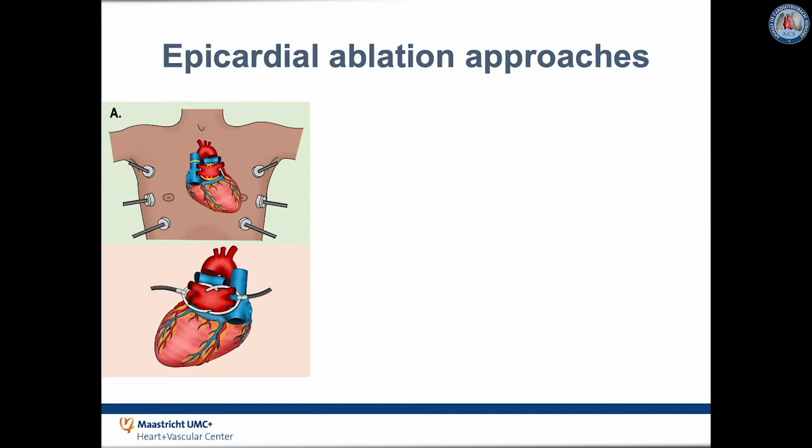Now there are several ablation approaches for the epicardial part, and I will discuss 3 of them which we use regularly in Maastricht. First of all, you have the bilateral approach. This is a 3-port access on the right side and a 3-port access on the left side.